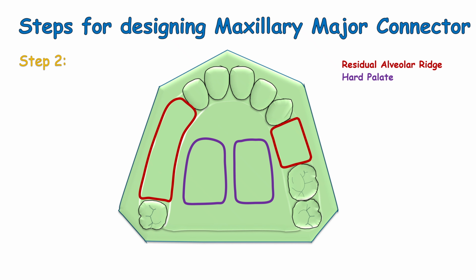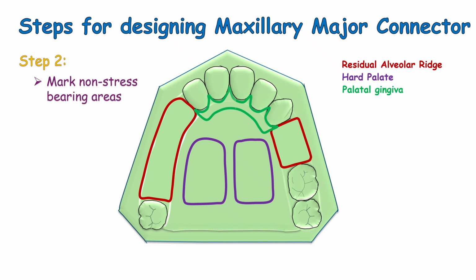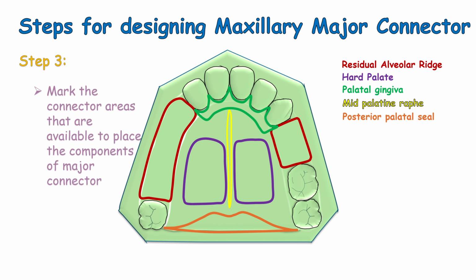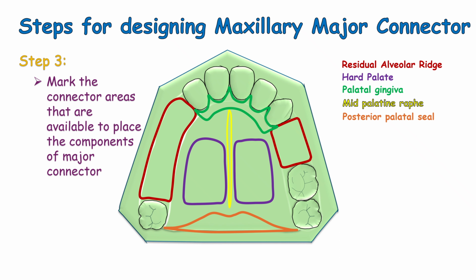Step 2, mark the non-stress bearing areas, which are the palatal gingiva, mid palatine raphe and posterior palatal seal. Mark all these areas with different colors. Step 3, mark the connector areas that are available to place the components of the major connector.